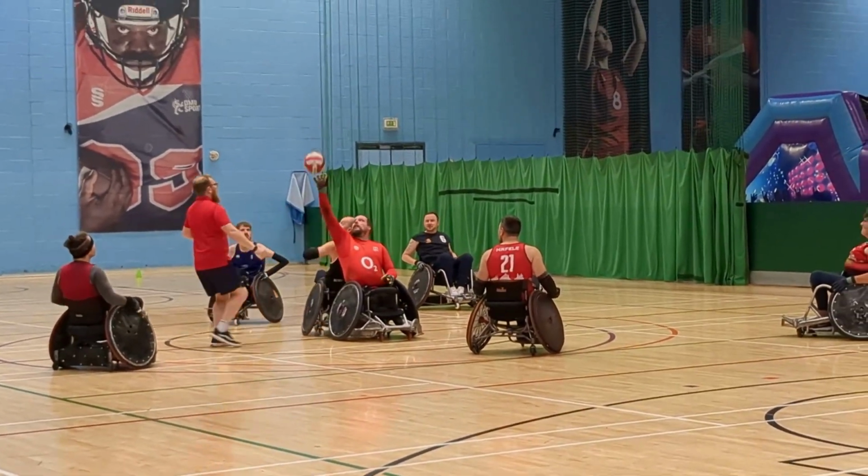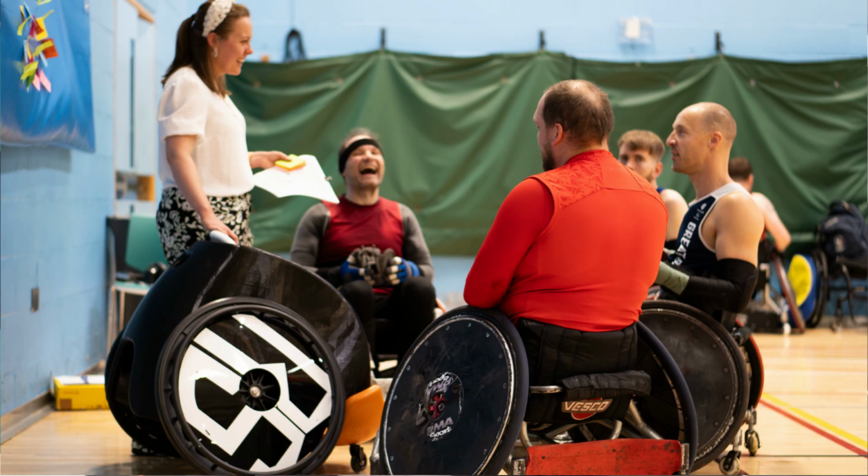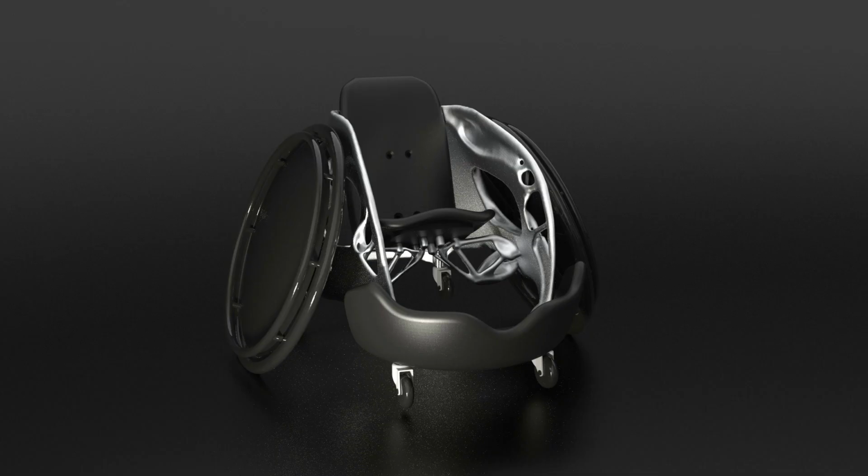In addition to this, we ran 3 wheelchair rugby workshops where we took our wheelchair design, we ran focus groups, we got user feedback, and we implemented all of this back into the overall design.